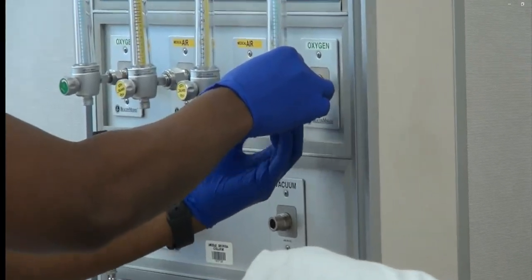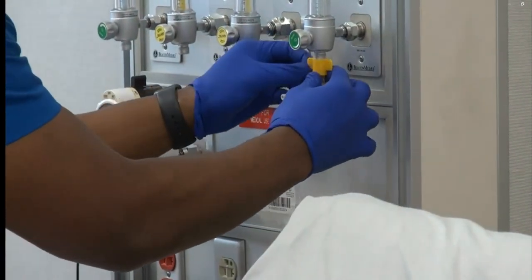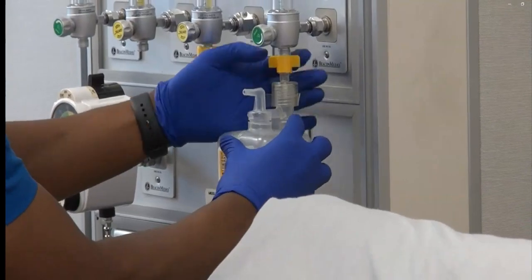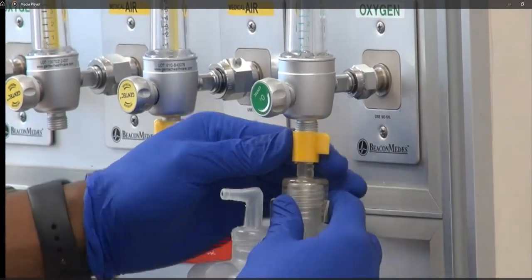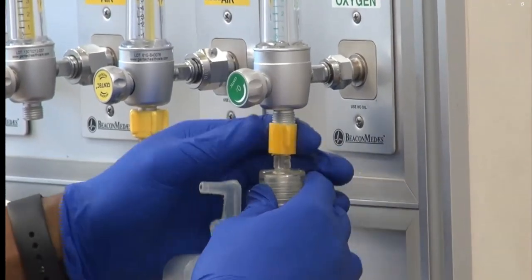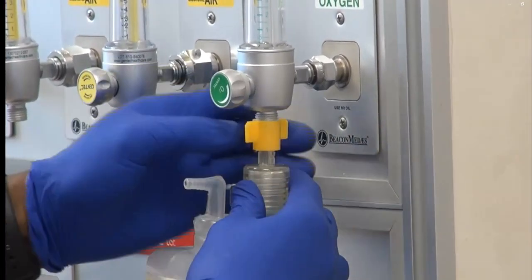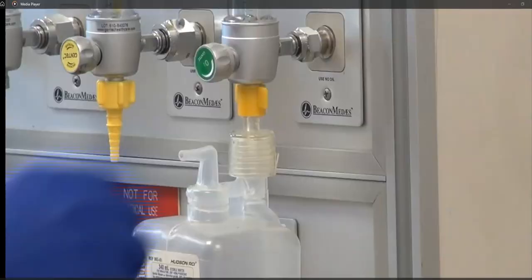Notice that in order to attach the humidity bottle, you need to remove the green Christmas tree adapter in order to properly place the humidifier. If you do not have a humidity bottle as pictured here, then you may verbalize that you are placing a humidifier and it's properly attached to the flow meter.